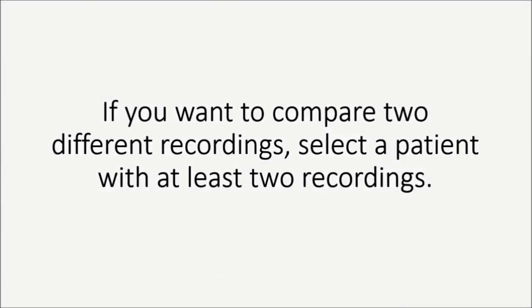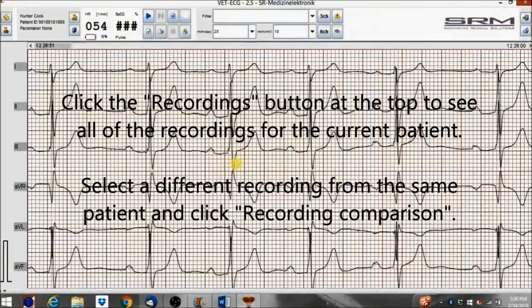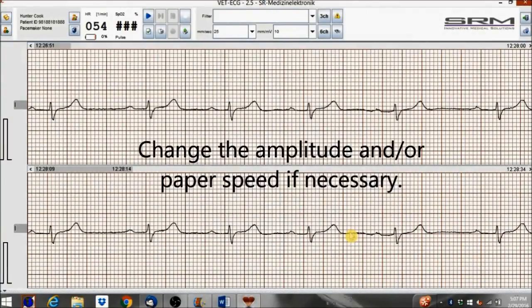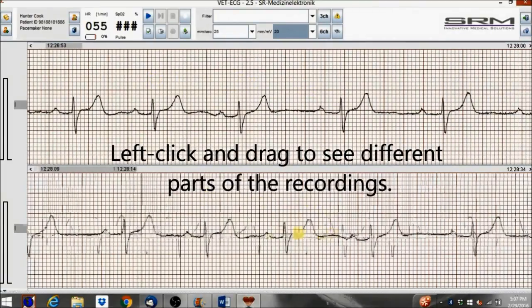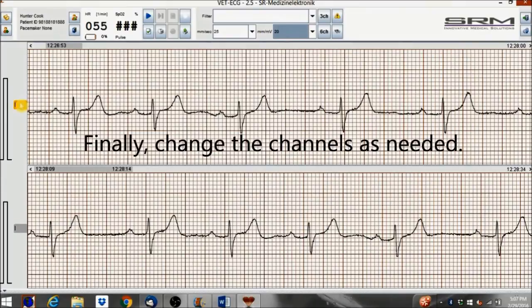If you want to compare two different recordings, select a patient with at least two recordings. Click the Recordings button at the top to see all of the recordings for the current patient. Select a different recording from the same patient and click Recording Comparison. Change the amplitude and or paper speed if necessary. Left-click and drag to see different parts of the recordings. Change the channels as needed.